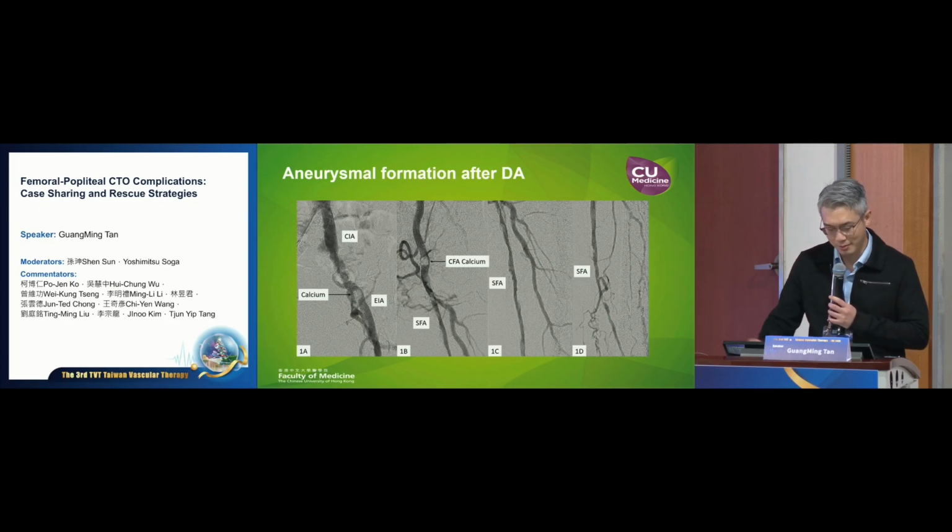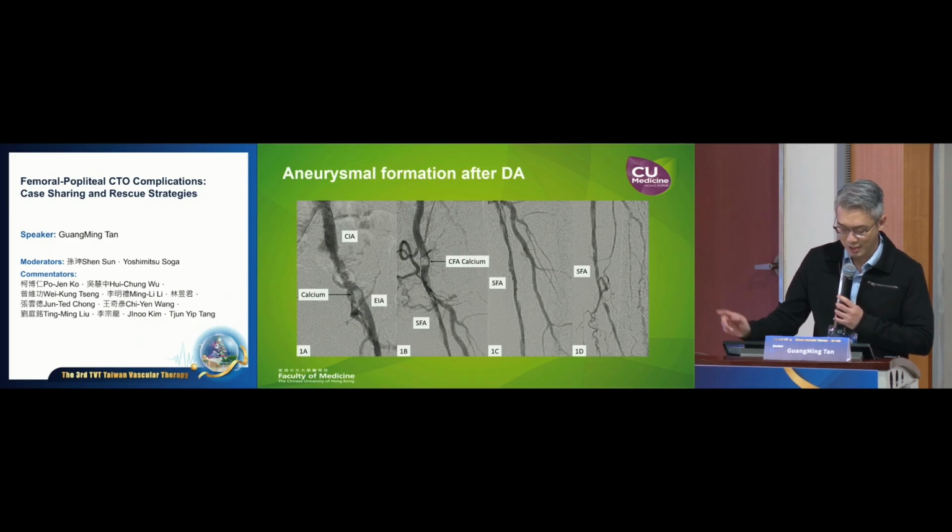Traditionally, of course, these cases should always be considered for surgical endarterectomy of the common femoral artery, and patch repair would probably be a better option if the patient agrees and the surgical risk is acceptable. But in this case, because the patient has a very poor cardiovascular reserve, we opted to do endovascular atherectomy of that calcium nodule at the common femoral site.